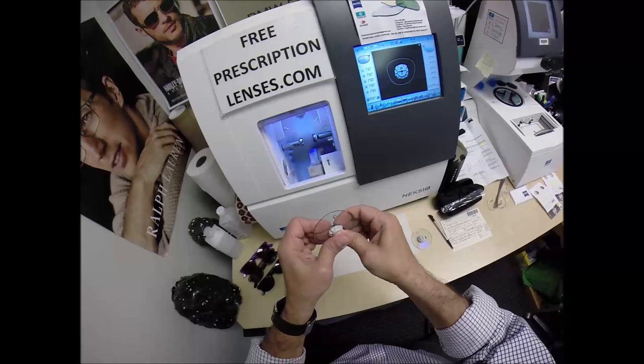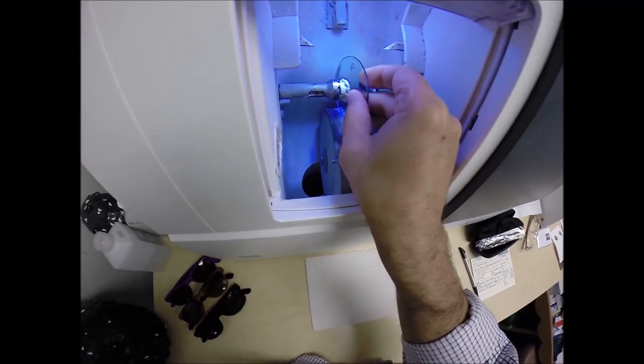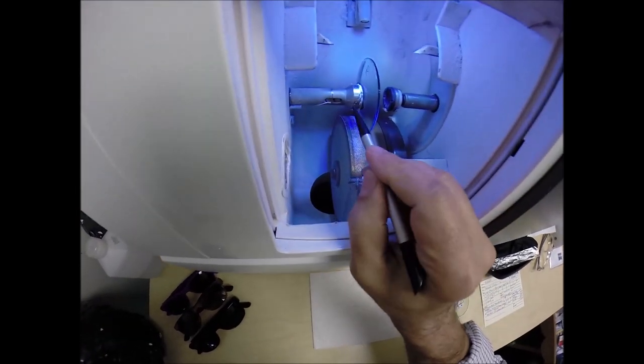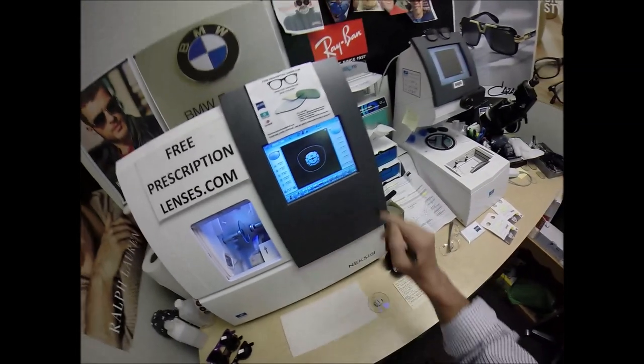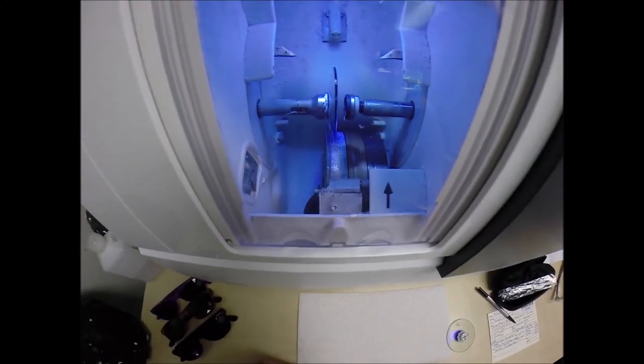So I'm going to press the sticker on there firmly. Now the magnet's going to do its job a second time. It's going to attach itself to another magnet there in the arm of what I call the Chuck. Actually, I call it the Charles because I just don't know this machine well enough to call it Chuck. Hit the green start button. The door closes. The clamp shuts.